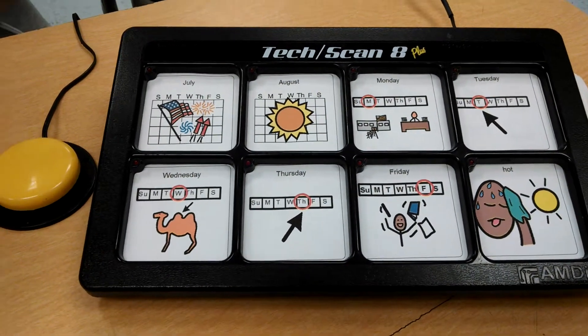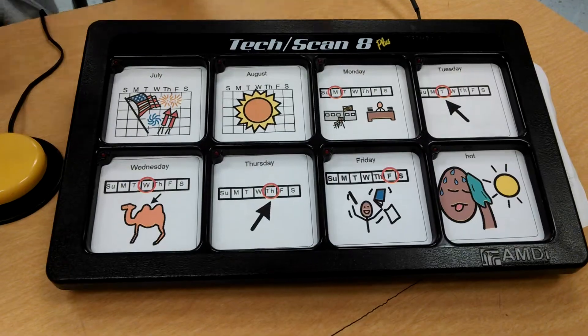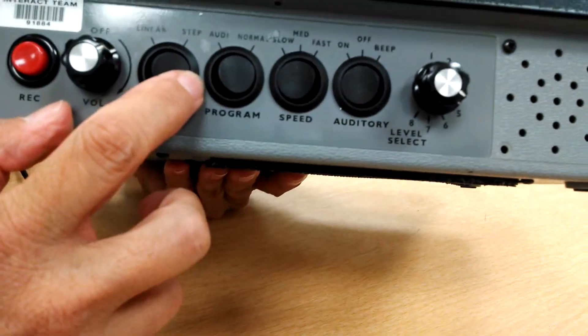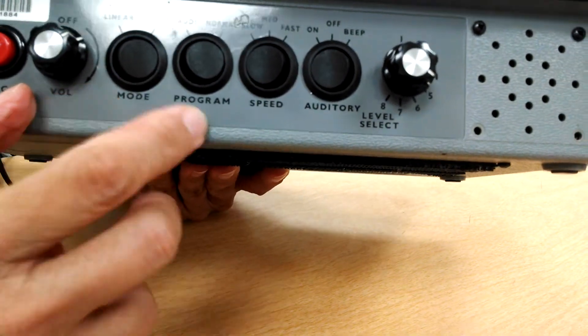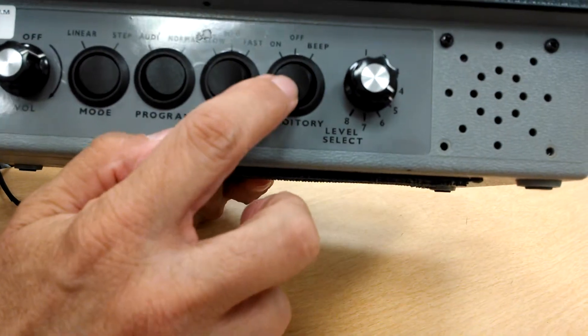Now let me go back and show you how to adjust the settings for the step scanning for the single switch user. You'll notice the device is on. I have the mode set to step, not to linear. The program is on normal. My auditory, I have it on on.